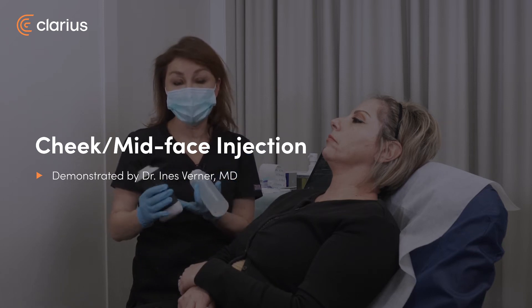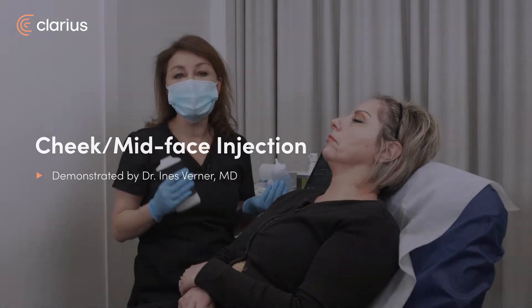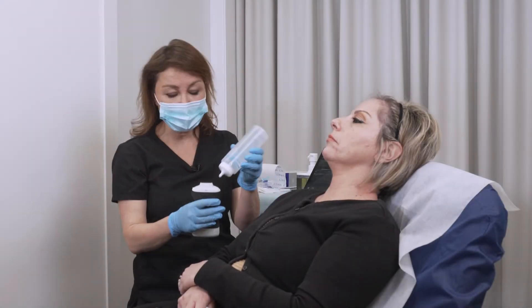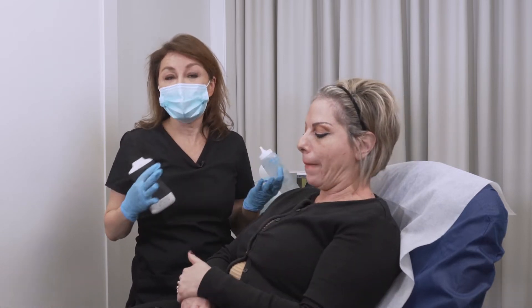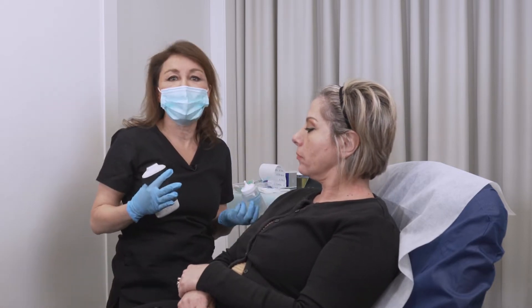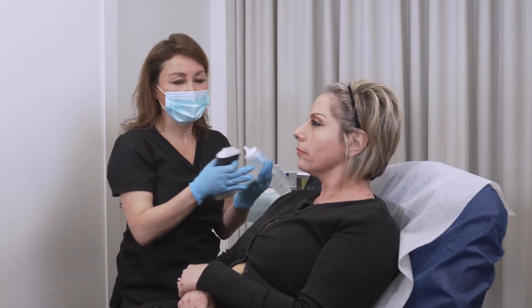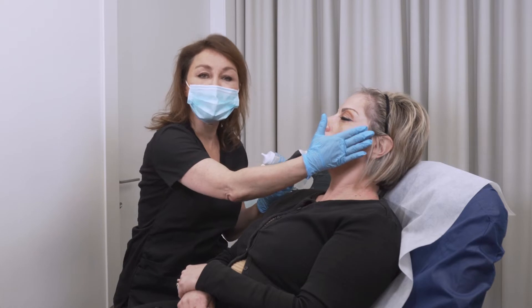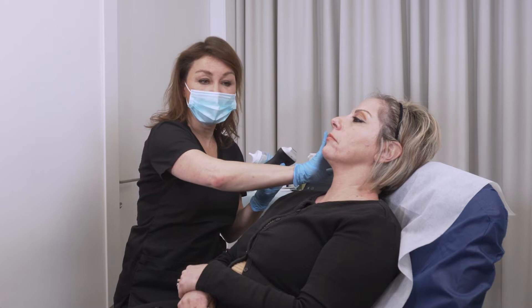Now we are actually going to inject the cheek and the midface. The midface is a very important area to inject and to improve the form of the face and how we look. In her case, we can inject both the lateral parts of her cheek and also the medial parts.